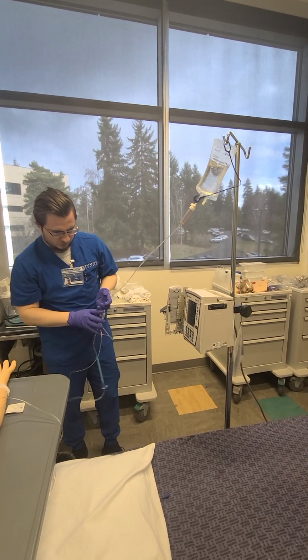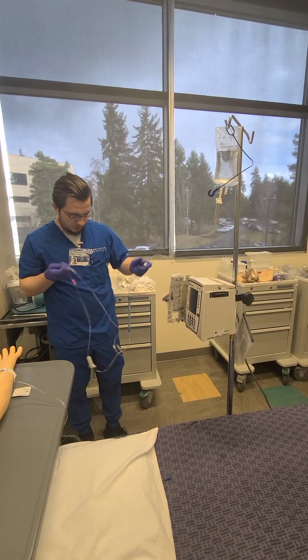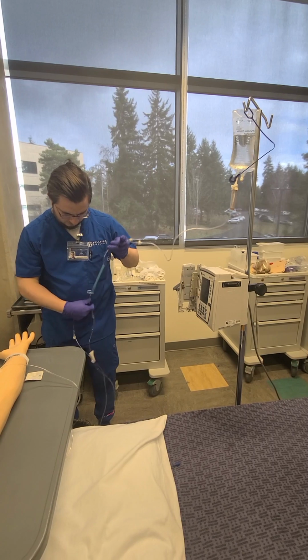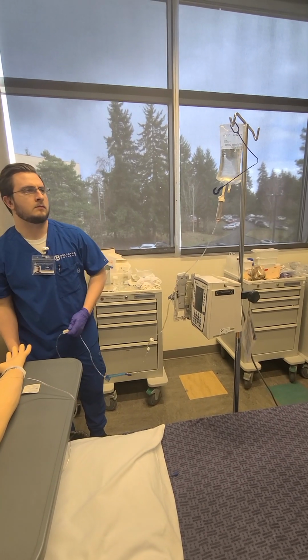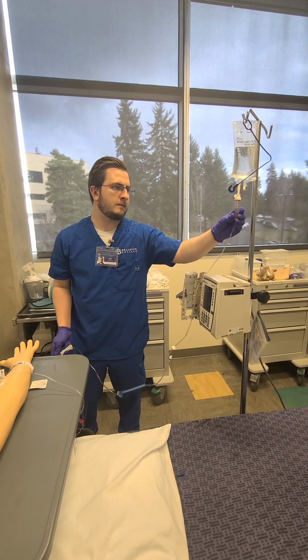Okay. Just gonna prime in here. Make sure there's no air bubbles. Take off my cap. Recap my blunt needle and attach my syringe cap. Fill up my chamber. I've already got about half. Good, the label on my syringe.